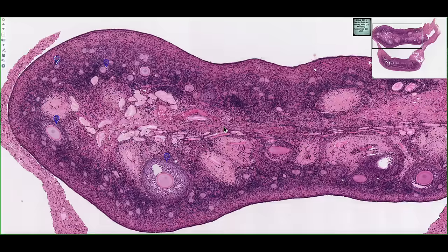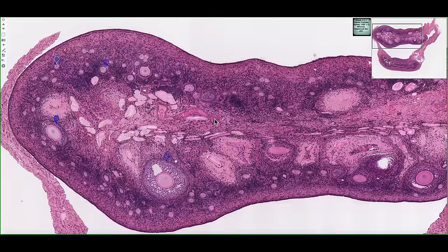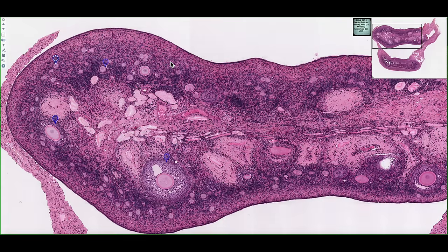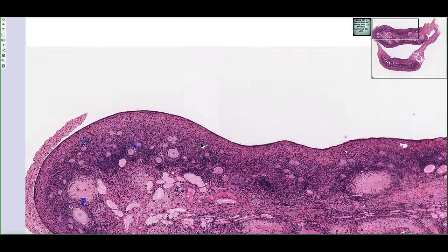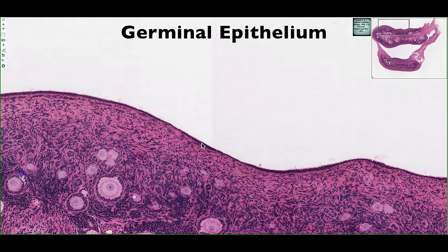This is a tissue section of an ovary, and similar to other organs, it can be divided into a cortex and a medulla. In the cortex, this is where we're going to see the ovarian follicles in various stages of development. As well as inside the medulla, this is where we're going to see contributions from the ovarian artery and the ovarian vein. On the most external surface or outer coat of the ovary, we'll see a layer of simple cuboidal epithelium.